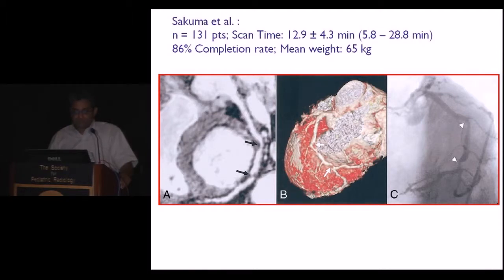When I apply a T2 preparation period of about 60 milliseconds, 50 to 60, this is at 1.5 Tesla, we get good contrast. And when I apply even higher, I start to lose the signal to noise ratio as well as the images look bad.